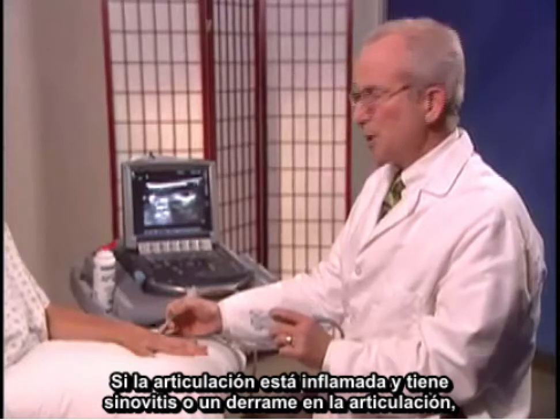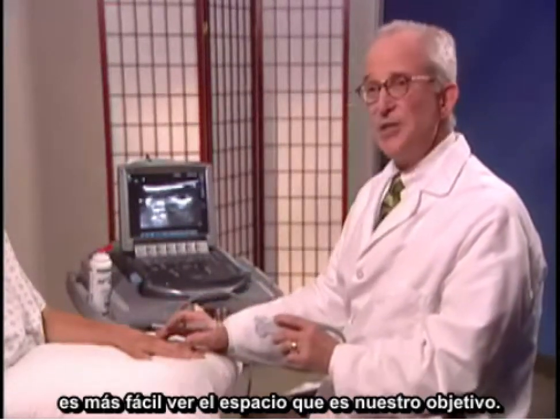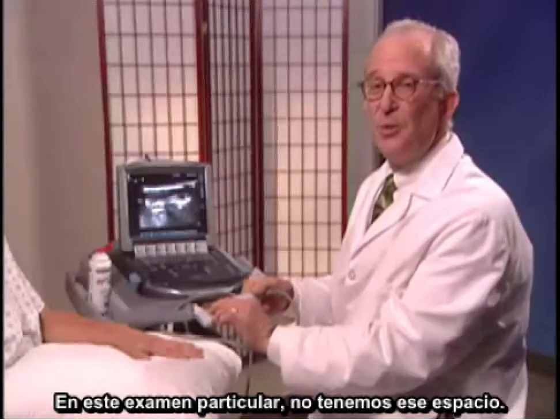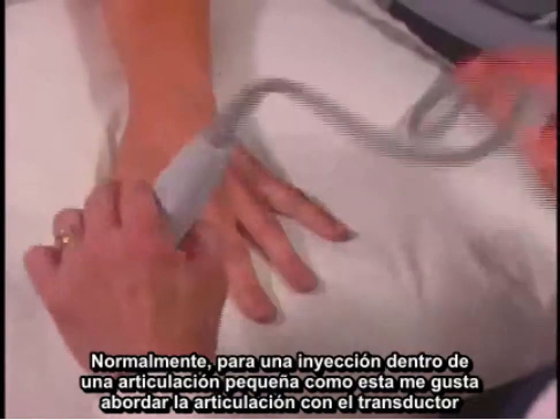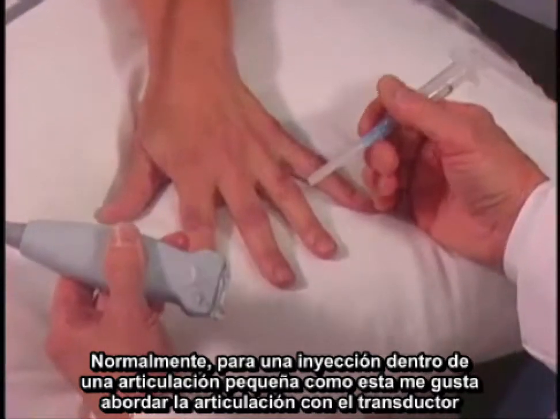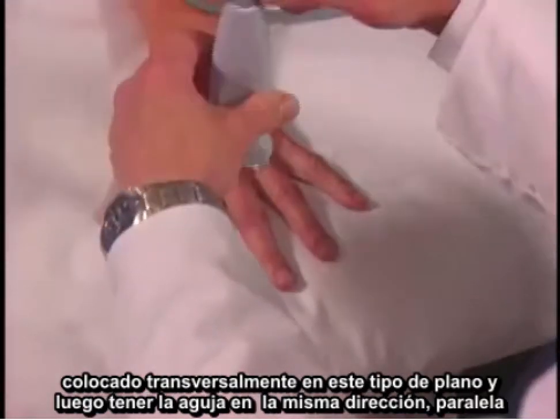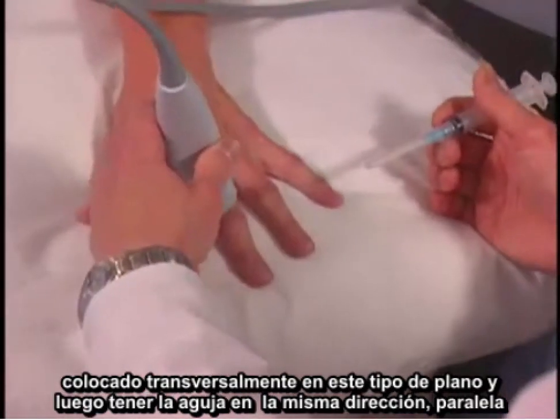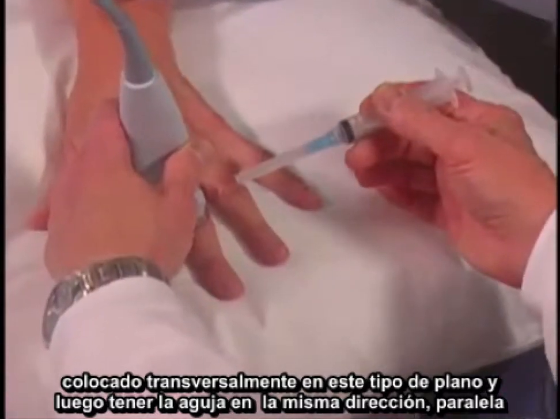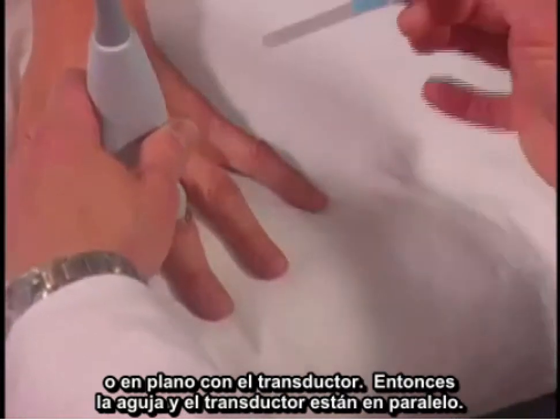If the joint is swollen and has synovitis or a joint effusion, it's quite easy to see the space that you're aiming for. This particular exam, we don't have that finding. Normally, for an injection into a small joint like this, I like to approach the joint with the transducer placed transversely, and then have the needle in the same direction, parallel or in plane with the transducer.